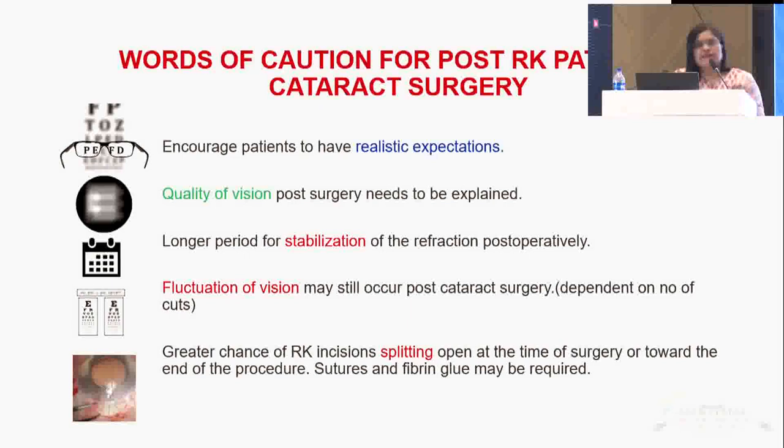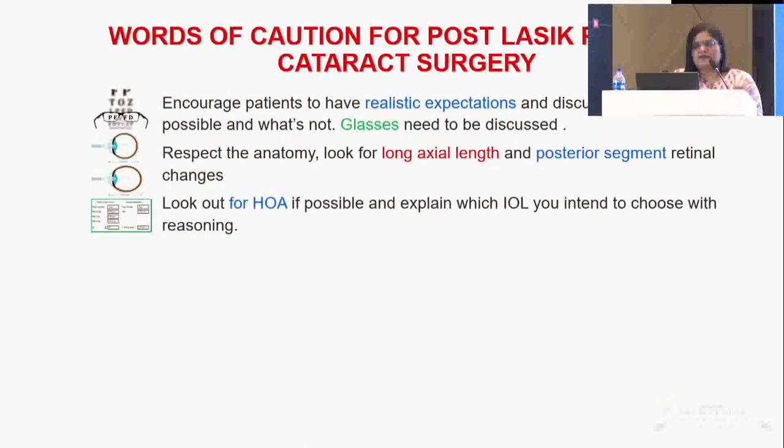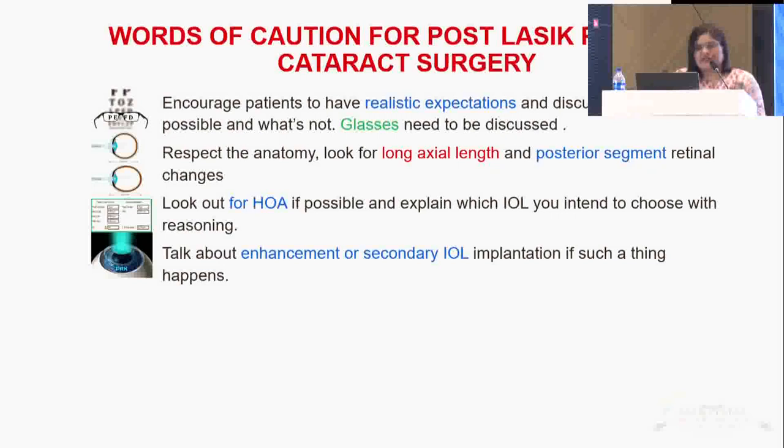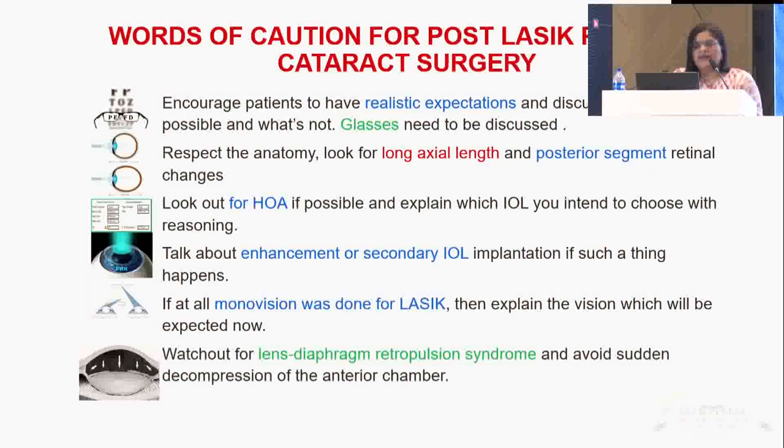And if you have a post-LASIK patient for cataract surgery, again, glasses, we need to discuss that. We have to remember the long axial length and posterior segment retinal changes. If there are any HOAs, we have to tell the patient why we are going for a particular IOL. We can talk about enhancement or secondary IOL implantation if that exists. If monovision was done for LASIK, then we have to explain which vision will be expected now. And of course, look for retropulsion syndrome and avoid sudden decompression of the anterior chamber.